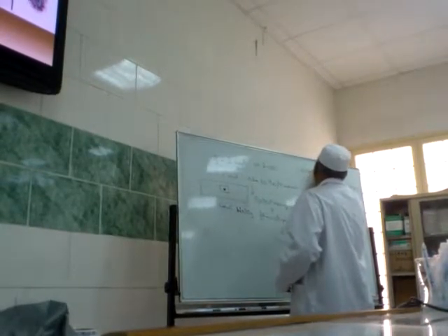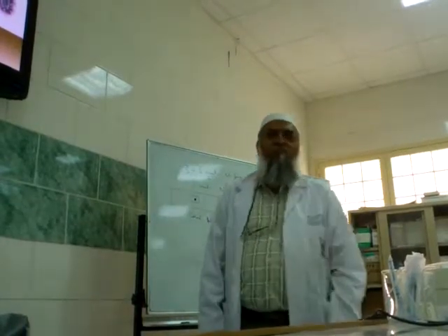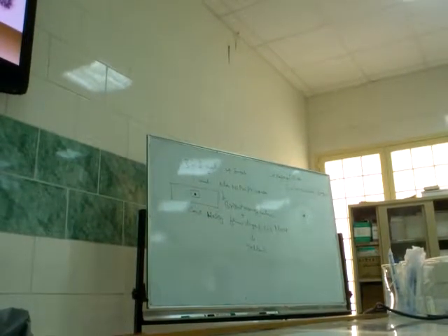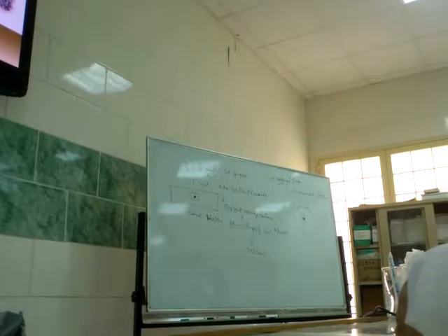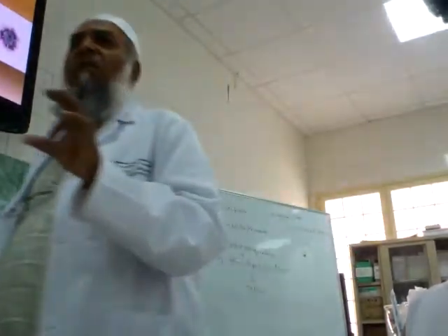The urea crystals will appear as hexagonal shape structures, just like the shape of the cheek cell that you observed in first year. Hexagonal in shape. Similarly, a hexagonal shape will appear in the urea crystals. So if you observe hexagonal shape structures in your slide, it means urea is present. Naturally, a normal urine sample must contain urea because it is the basic nitrogenous waste material to be expelled out. So observe your slide under the microscope after preparing.